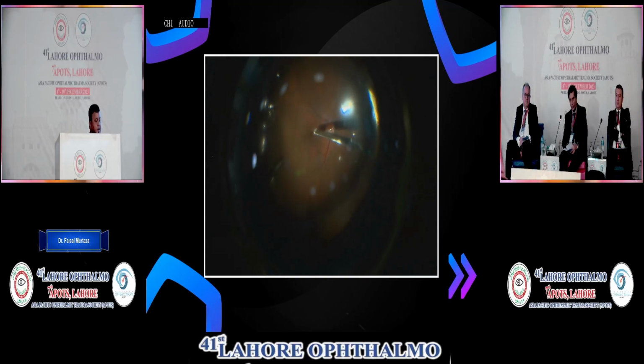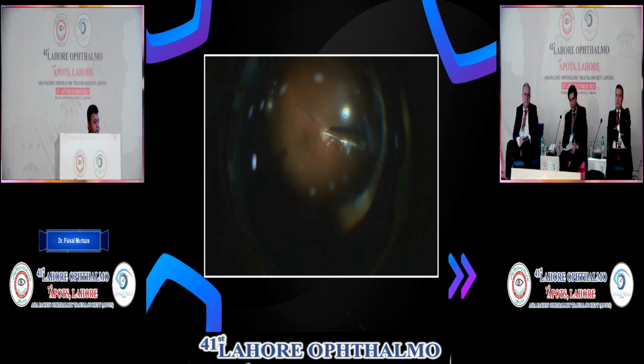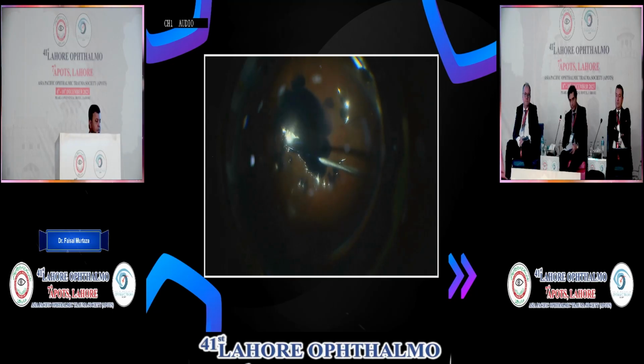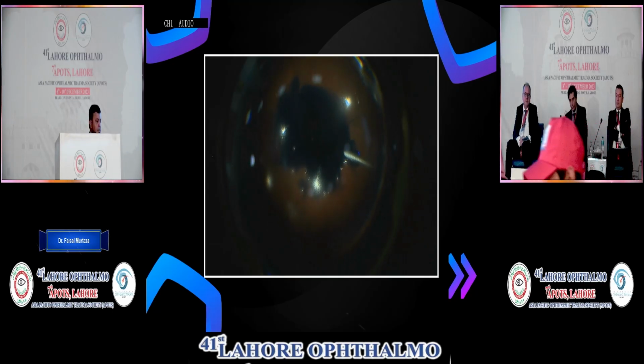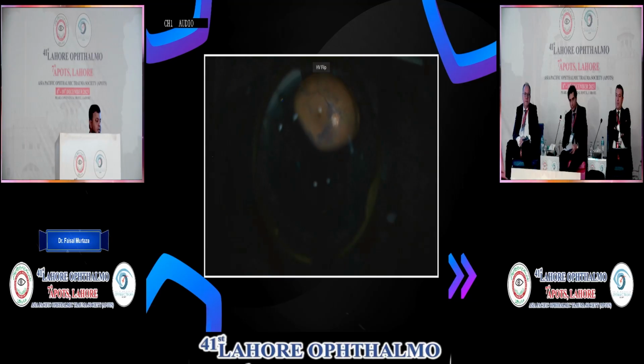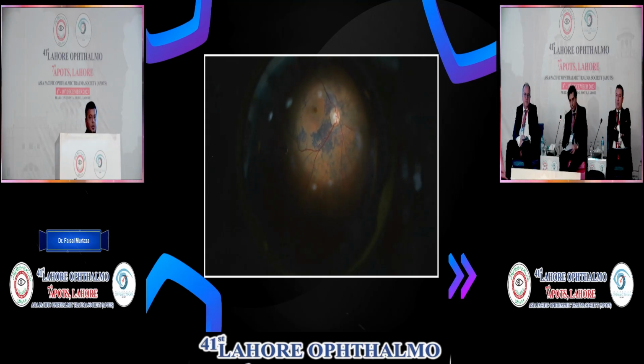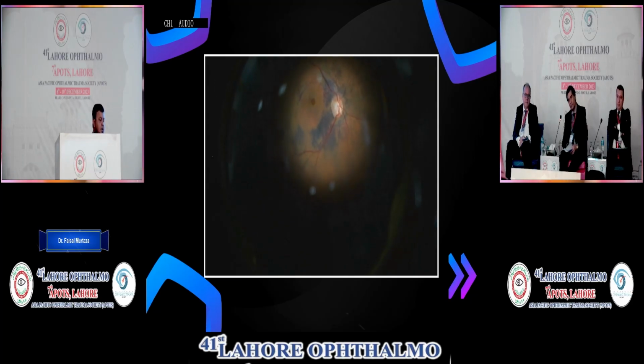Vitrectomy was already done. We stained the ILM with BBG to see any remnant of the ILM. And you see there was no ILM detected at the posterior pole around the macular hole. After that, we plan to do the relaxing incision at the superior and inferior margins of the macular hole.